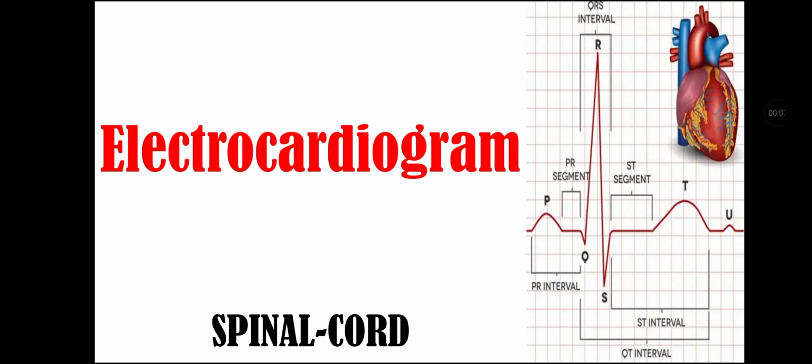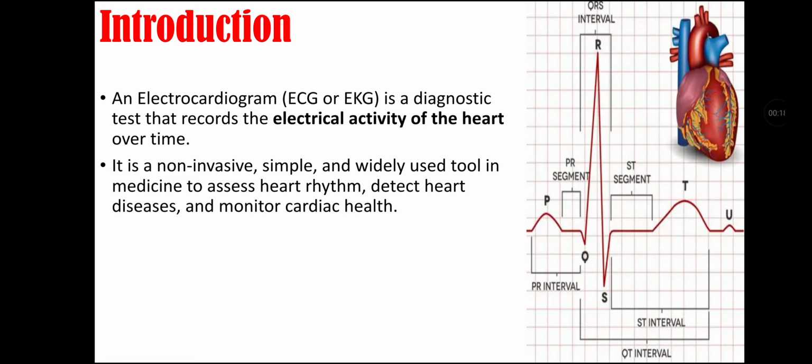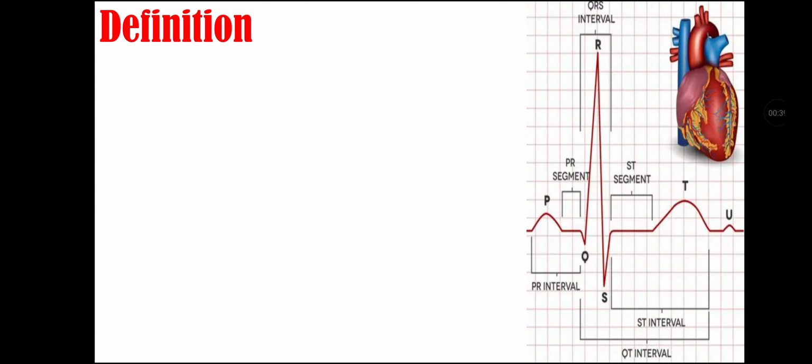So let's start our topic with introduction. An electrocardiogram, also called an ECG or EKG, is a diagnostic test that records the electrical activity of the heart over time. It is a non-invasive, simple, and widely used tool in medicine to assess heart rhythm, detect heart disease, and monitor cardiac health. By analyzing the heart's electrical pattern, healthcare providers can identify arrhythmias, ischemia, myocardial infarction, and other cardiac conditions.